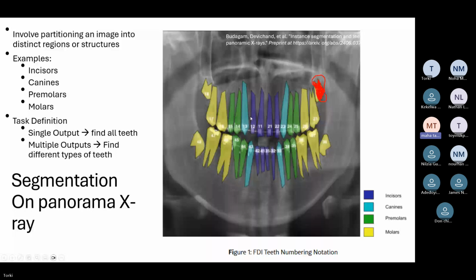I think what you're trying to demonstrate is that some of the yellow of the original 28 is not covered, and the red circle is also including something else. Yes, this is not included. And yes, so it includes something which is not 28 and misses part of 28.